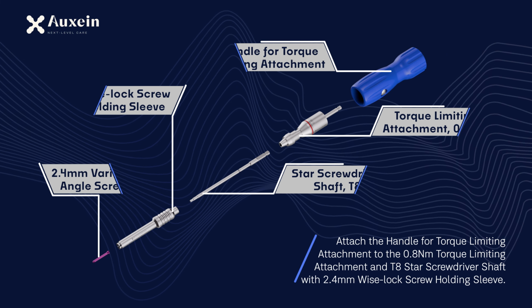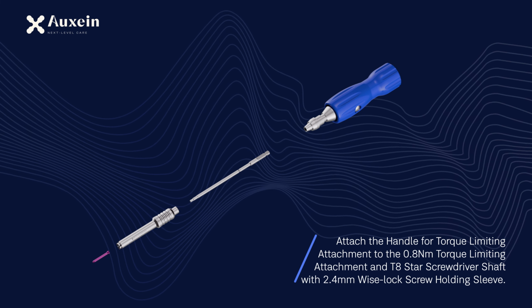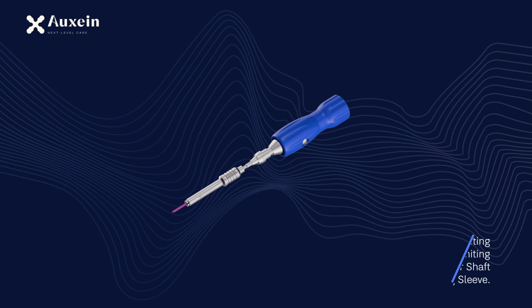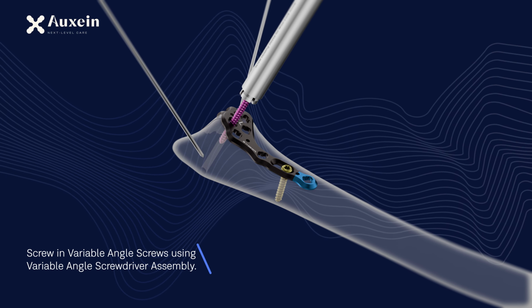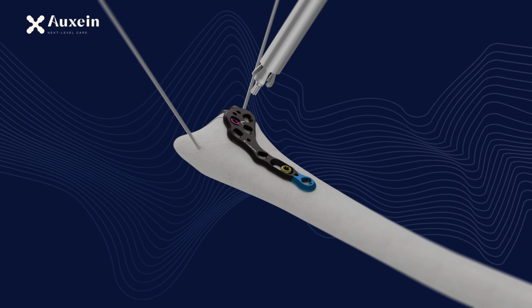Attach the handle for torque limiting attachment to the 0.8 Nm torque limiting attachment and T8 star screwdriver shaft with 2.4mm Wiselock screw holding sleeve. Screw in variable angle screws using variable angle screwdriver assembly.